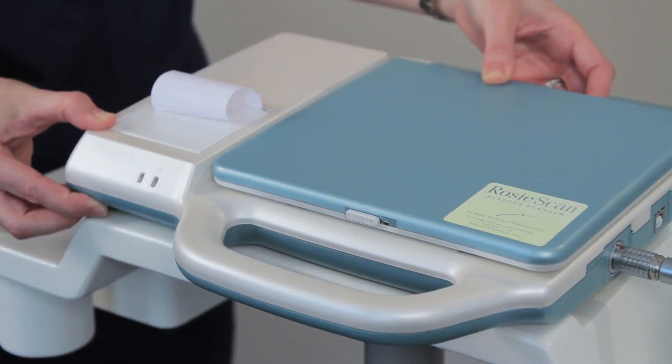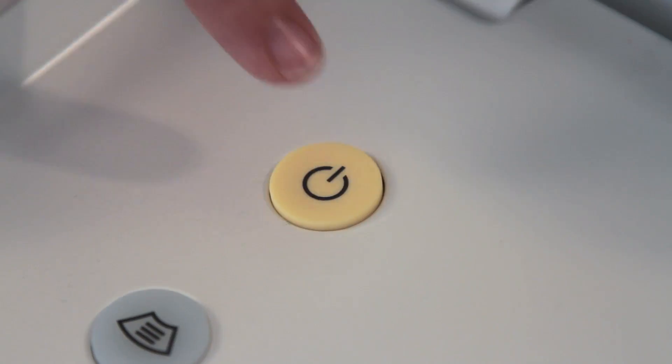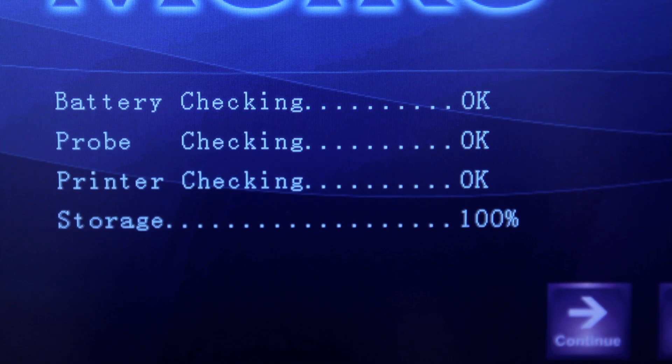Next, secure the device tightly to the accessory tray attached to the rolling cart. To turn on the device, press the power key. The device will automatically check the battery level, printer, probe connection, memory capacity, and screen.